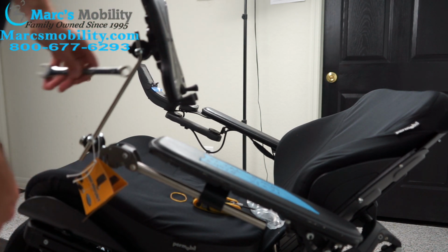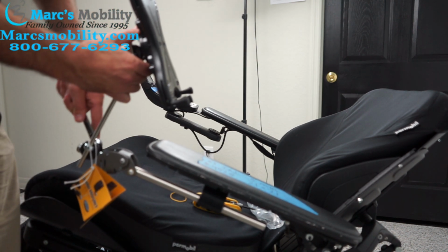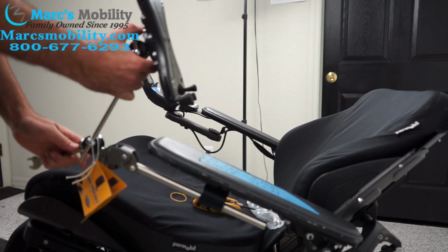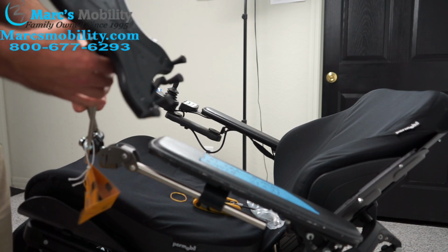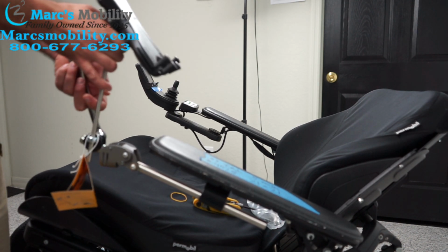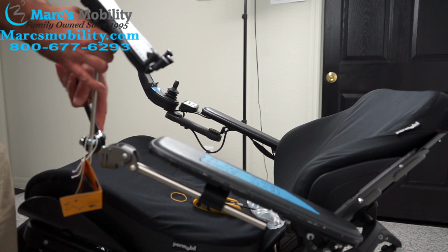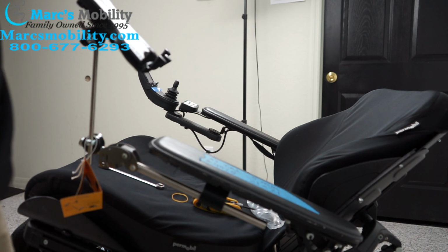And there's our tablet holder. There's another 1/2 inch nut on this side. If you want to adjust that, you can. No, other way. See, I can tilt it in, out, up, down, wherever you have it, you can just tighten it again. And there you are. We have a tablet holder mounted onto a Permobil.